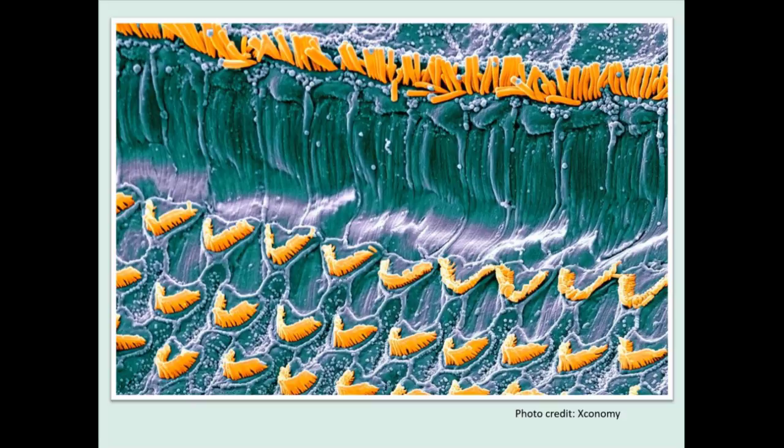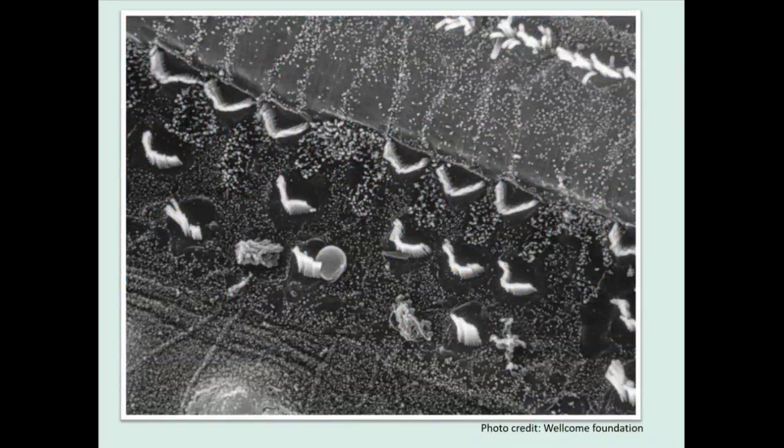However, the challenge is, to be honest, what is the most reliable way to measure this energy? Finding solutions to that has kept me interested in this field for pretty much my entire working life. This slide is just a quick reminder of what the cochlea looks like once it's been subjected to too much sound. Many experiments have shown that as the outer hair cells diminish in number, the otoacoustic emission reduces and eventually disappears. Along with it goes our good hearing threshold and our ability to understand speech in noisy environments.